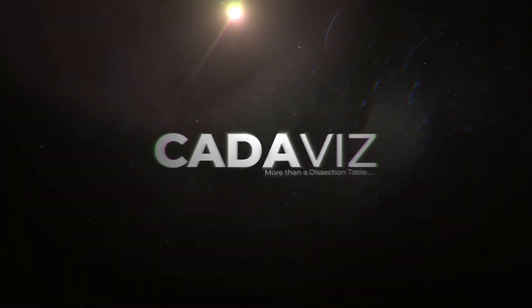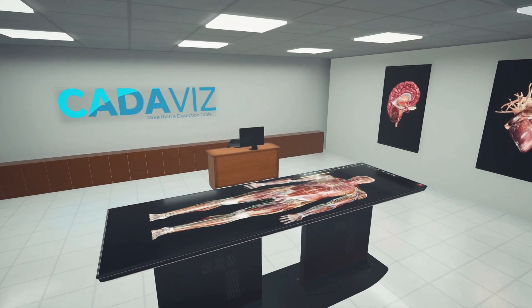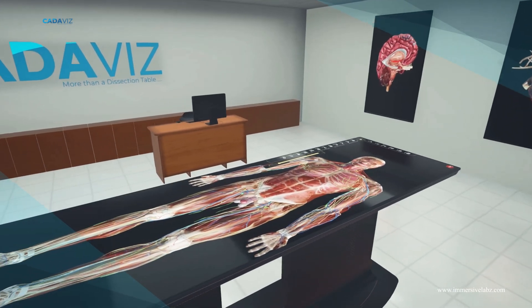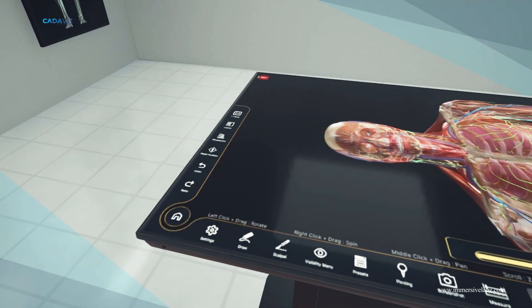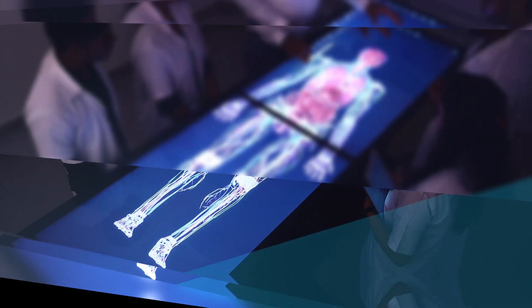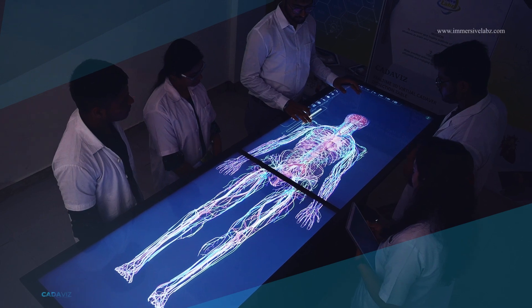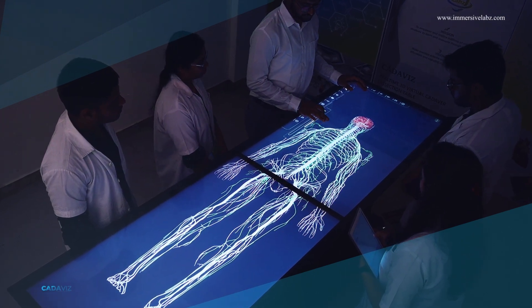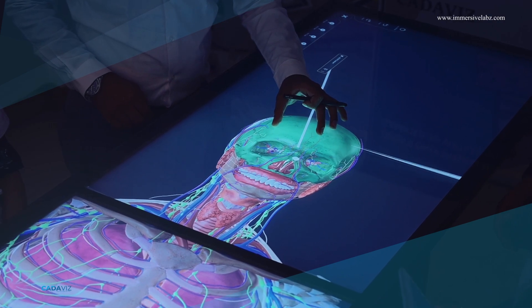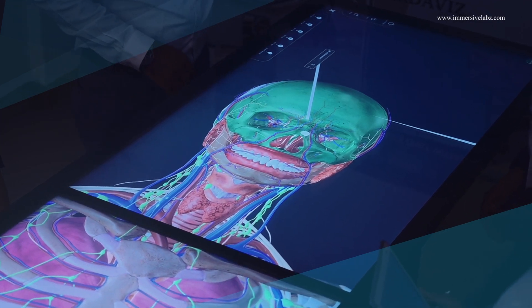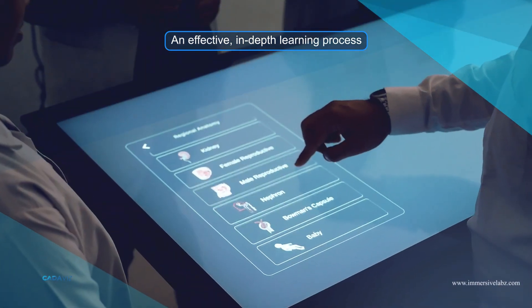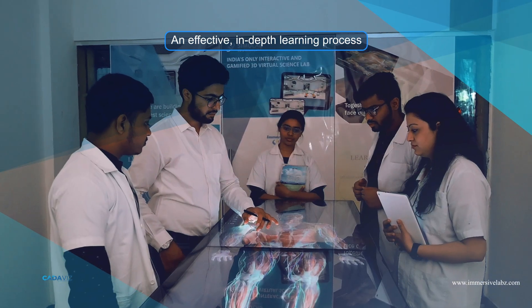Immersive Labs introducing CADAVOR, a virtual cadaver dissection table. With the use of the virtual cadaver dissection table, users may recreate the cadaver dissection procedure and see every body part in exquisite anatomical detail. The system is created with doctors, labs, surgeons, and medical students in mind.